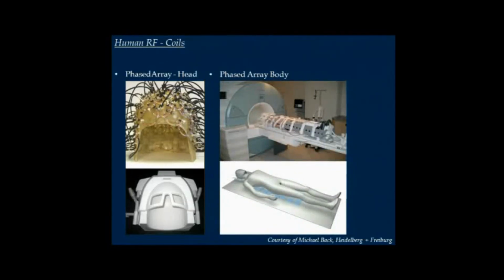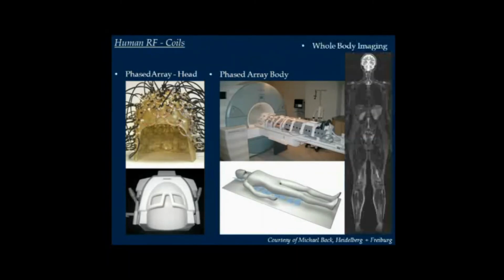So you can really mummify the poor patient, if you like, and with moving table even have acquisitions exactly like in CT. Once you apply sequences where you can move the table, then you can do whole body scans and switch through the coils with switching on and off the interesting array coils, surface coils, to completely scan the body. Has large application in metastasis search, of course.